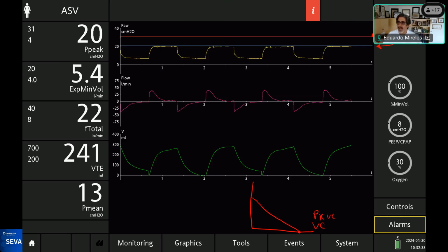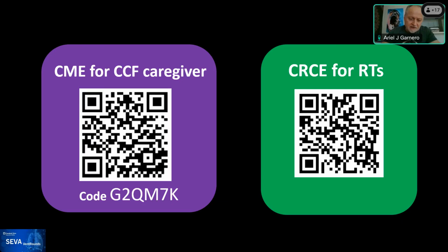So it's an important feature, but I agree completely that if you're looking at the amount of driving pressure that is required for these patients, volume support, PRVC, and ASV would behave that way, correct? I mean, yeah, we need to remember that ASV is an evolved, adaptive targeting scheme. At the same time, it has more safety features, but still it could lead to an unwanted decrease in the level of assistance. That's perfect.